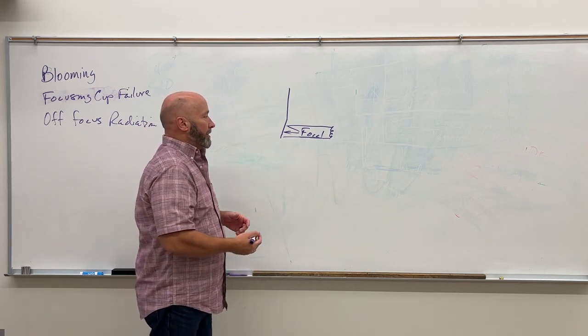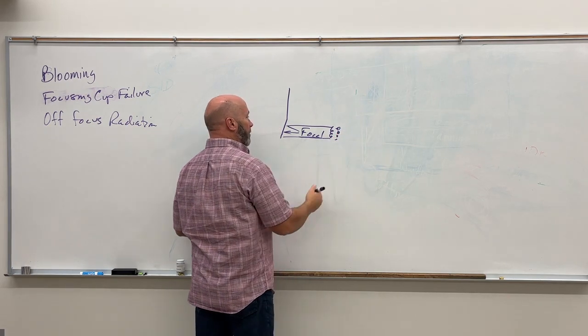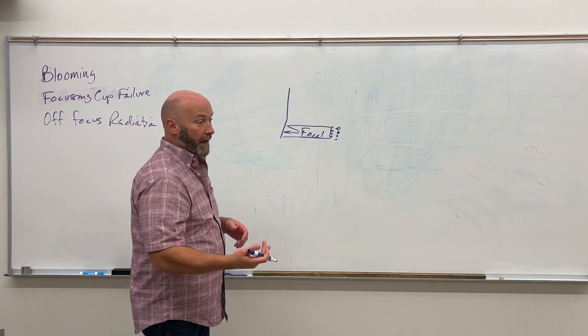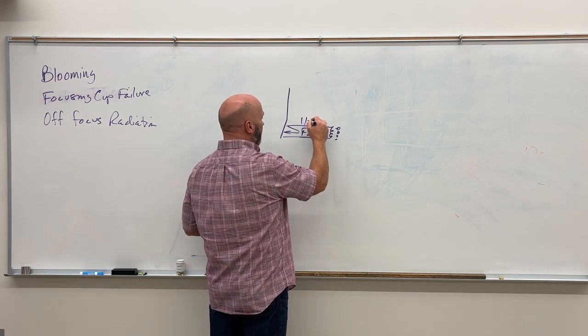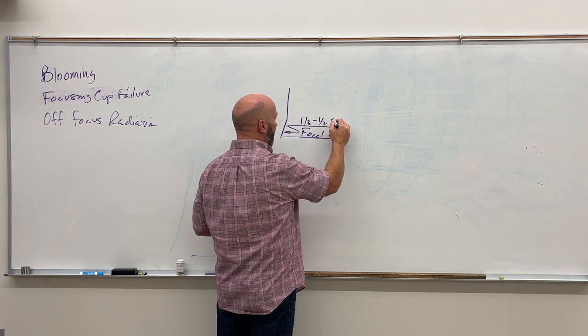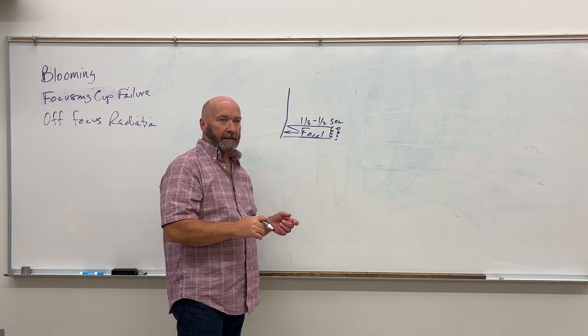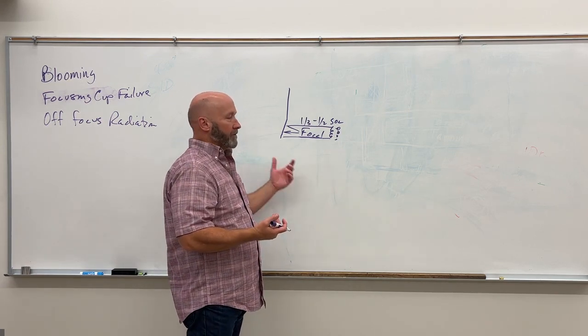Keep in mind we've got a lot of electrons, and whenever we hit it with kVp, the electrons travel across the tube at an extremely high rate of speed, anywhere from one-third to half the speed of light. They're traveling very, very fast. And even though they're tiny, almost to the point of non-existence, they're still matter.